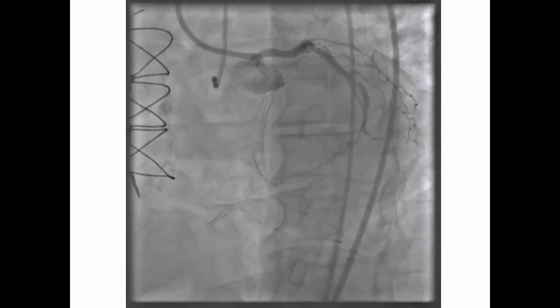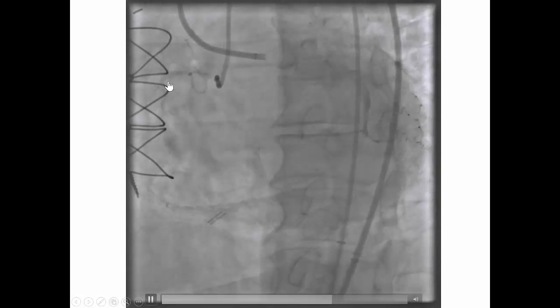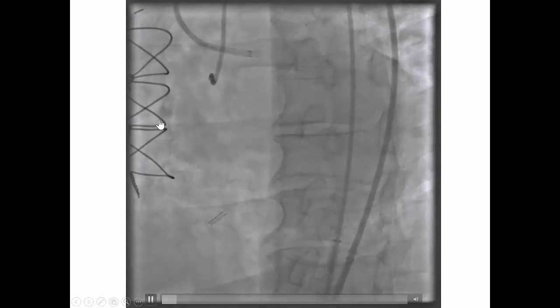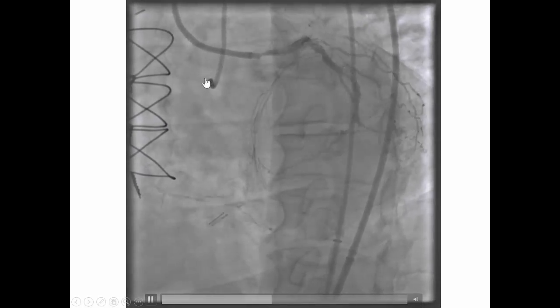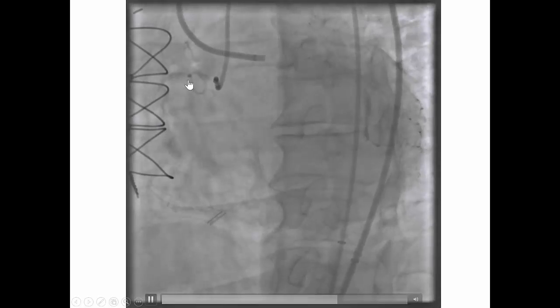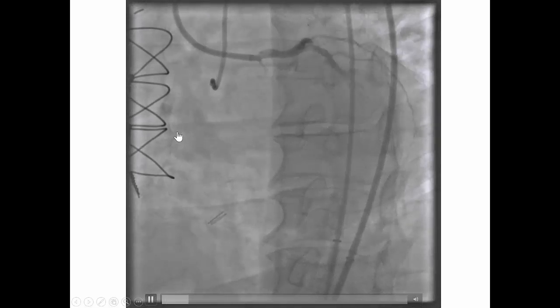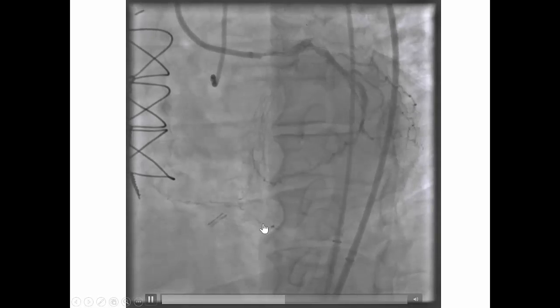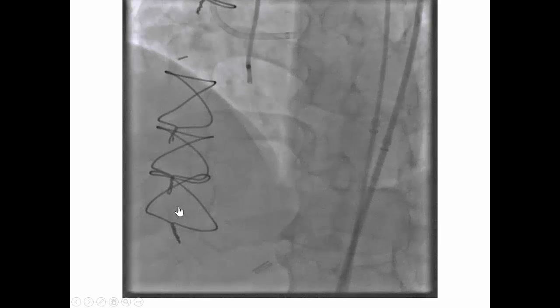The patient was a previous bypass patient, which is important because such patients often have severe calcification leading to balloon uncrossable lesions. He was referred for PCI of a right coronary artery CTO. The right coronary artery was occluded in the mid-segment, and there was filling of the distal RCA in the PDA via collaterals from the left system.